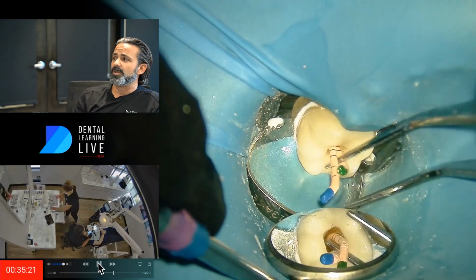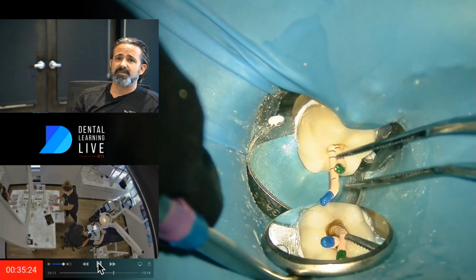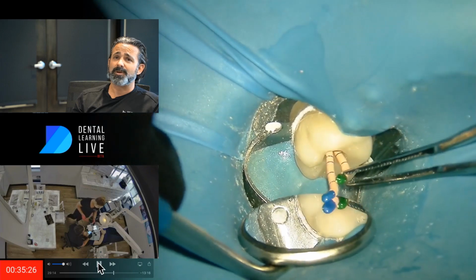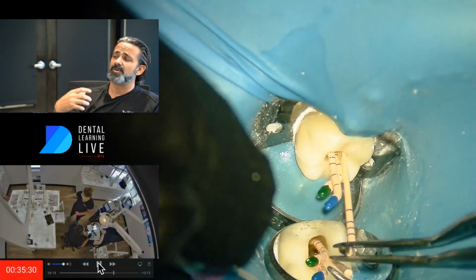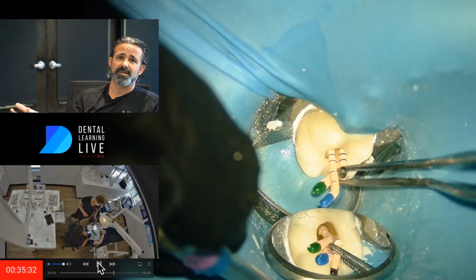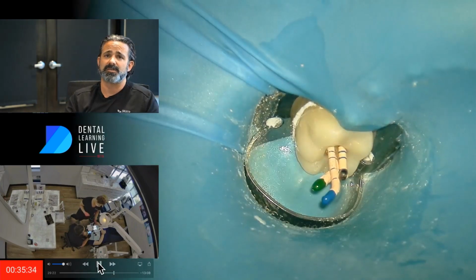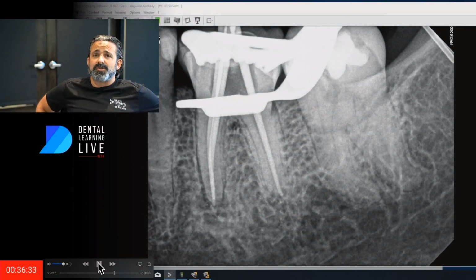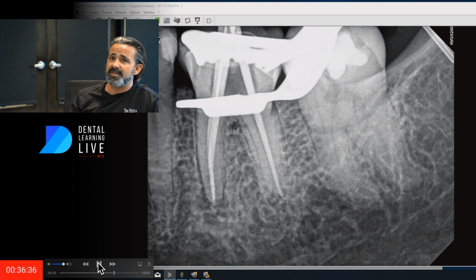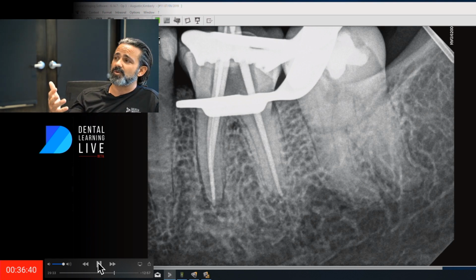And so I've learned just at this point, it's kill two birds with one stone. I'm going to go check my length again. And if I have a little bit of heme, I'm going to do that under the hypertonic saline and just let that clot naturally form down there. And I take another working length. Now, I use my trim cones from the first go around in the second go around. And that's kind of nice too, because I can either go up a size or trim again if I want. And in this case, I'm going to trim just a little bit more.